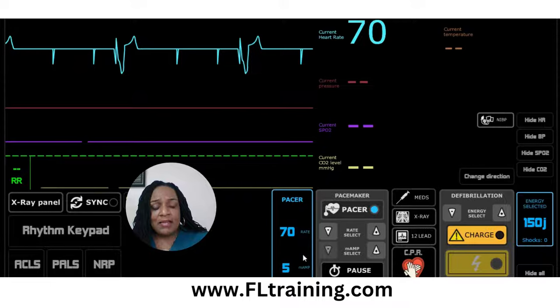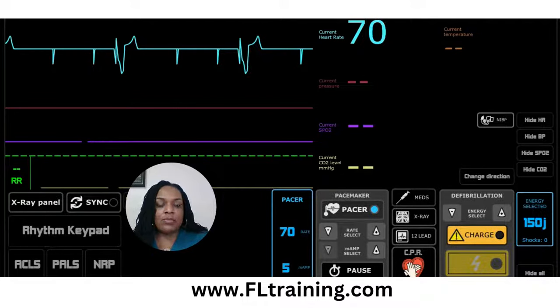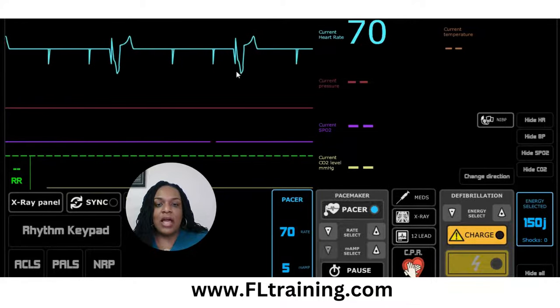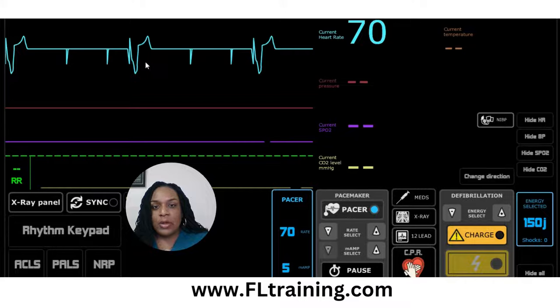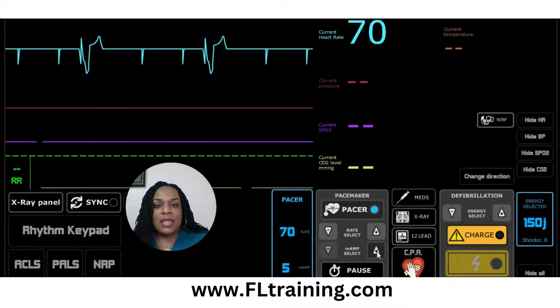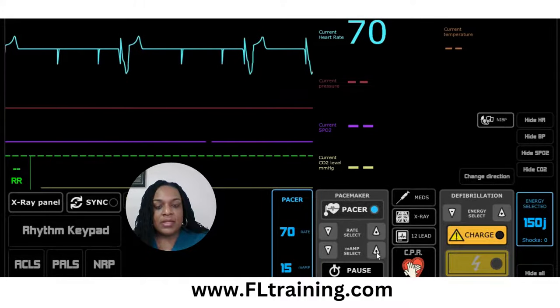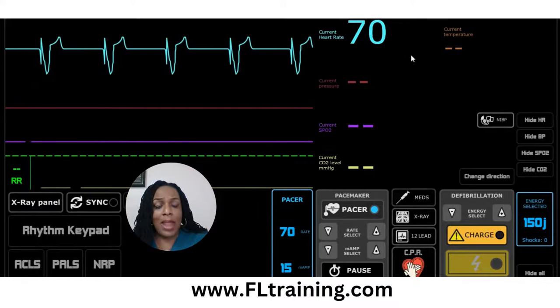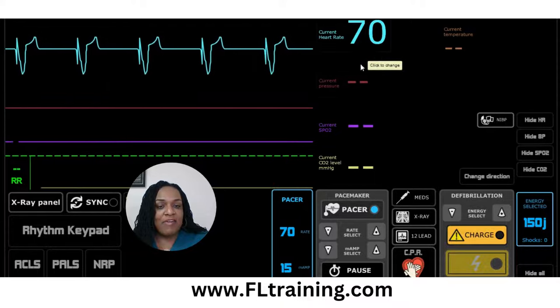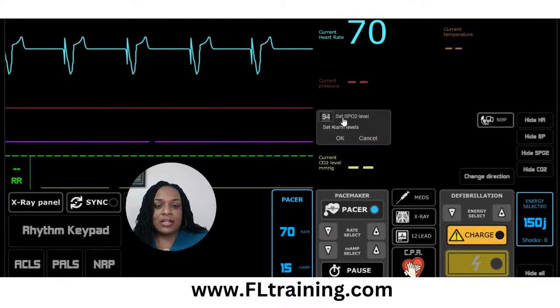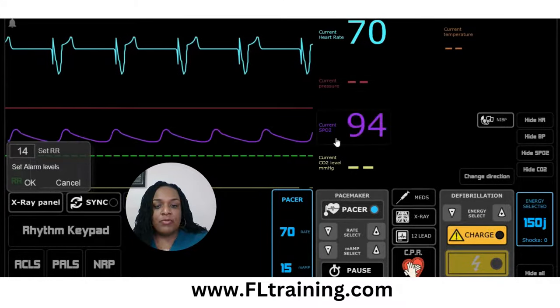Down here we have our milliamps. We need to increase them until we have 100% capture — I want to see a QRS complex behind every pacer spike. Right now the patient's heart rate is about 30 per minute, which is too low to support life. Every time you increase your milliamps, your patient feels discomfort because that is more energy they're going to be feeling. Your patient is probably saying 'ouch' about 70 times per minute. But we don't treat monitors, we treat patients. Go back and verify the heart rate is actually 70. When you recheck the blood pressure and vital signs, you should start seeing some improvement.